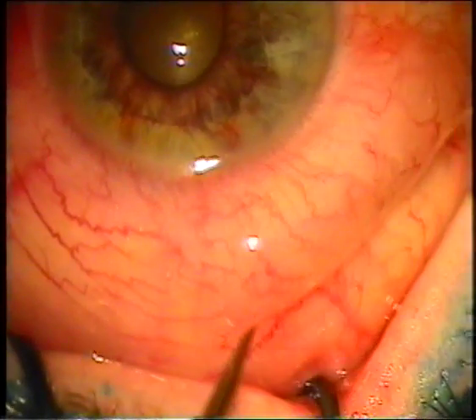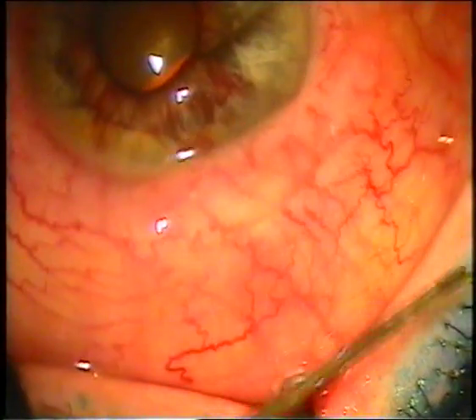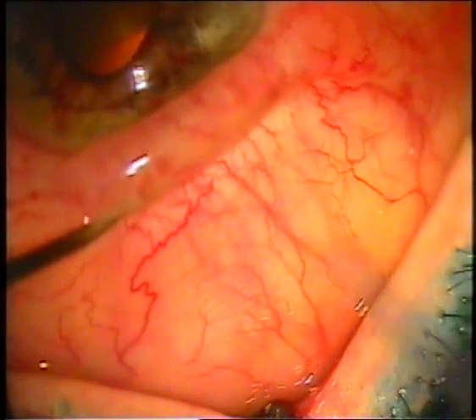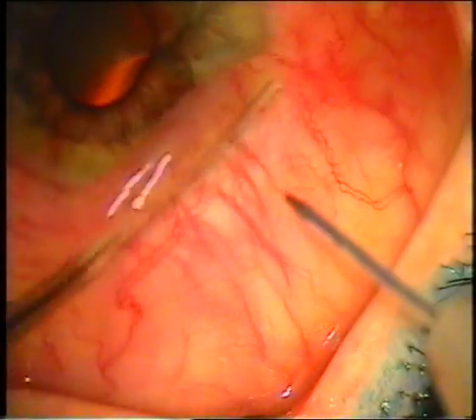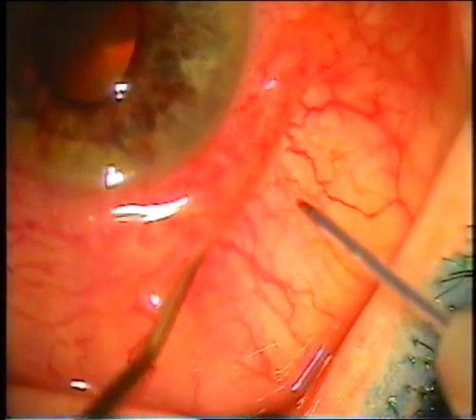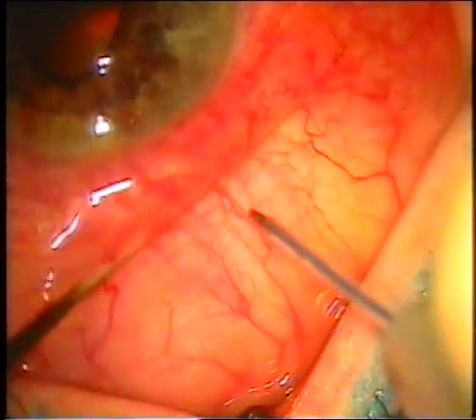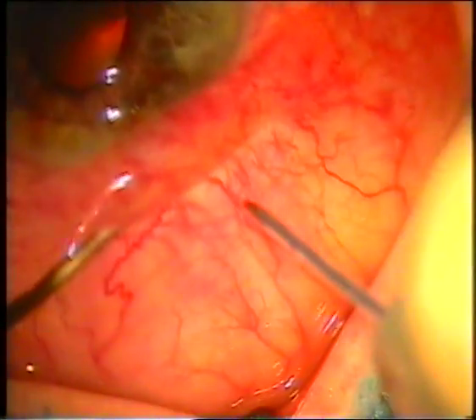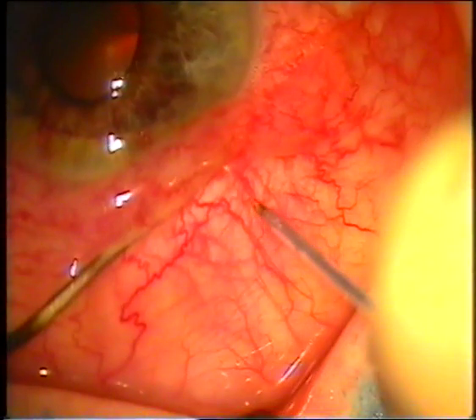We uplift the conjunctiva with the help of 2% lidocaine solution. With the help of a spatula we disperse this solution under the conjunctiva. We feel that when we use this technique we should wait for a sufficient period so that the fluid can disperse evenly, otherwise we can have some thermal burn when we do TCTF.